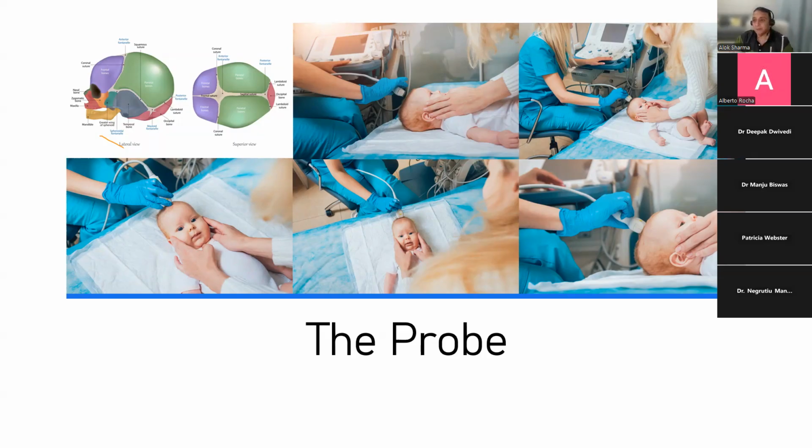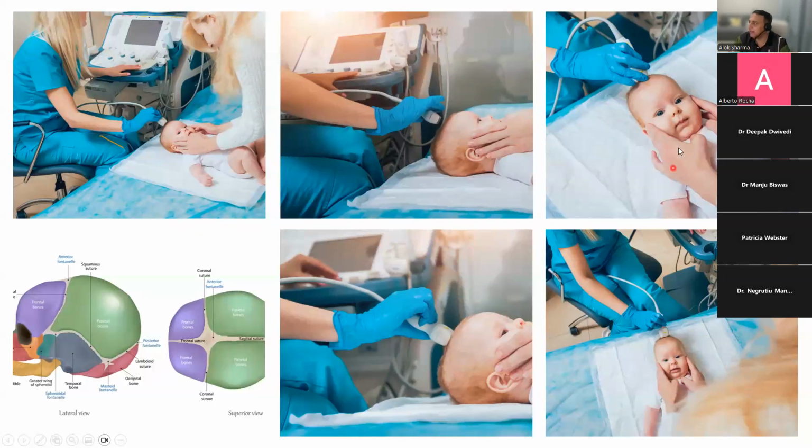That being said, that's easily overcome by what they're doing at this particular point. They're holding the probe and containing the baby beautifully. He looks comfortable over here. He looks inquisitive when you look at the slide on the right-hand side. He's kind of wondering, well, what exactly is happening over here? He's kind of quite thoughtful. Oh, are they looking at my brain at this particular point? But what you can see is now he's uncomfortable. Now, even small amounts of pressure applied very hard will result in pain, and they will just compromise your images. But just a good overview of how you can get good control.